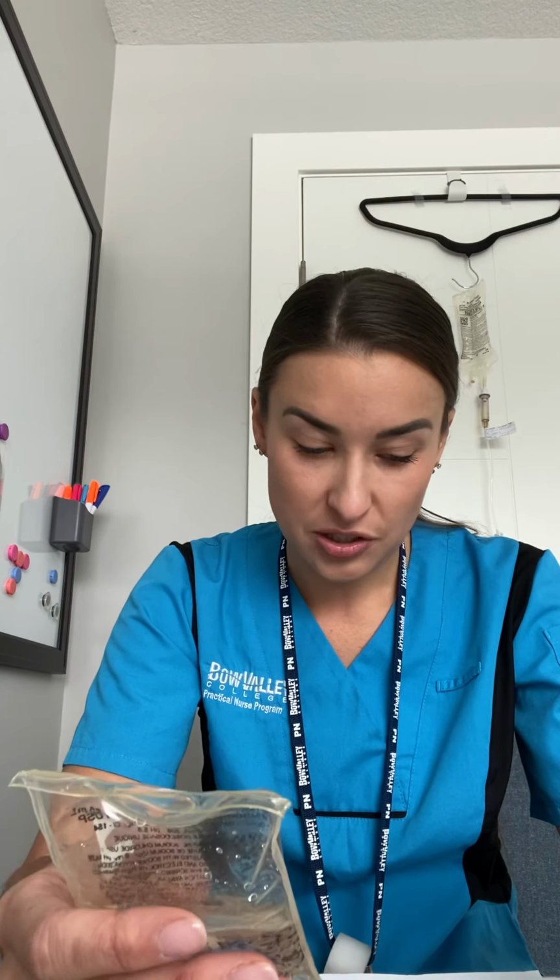we just want to go through the checks on our normal saline. So right here we have 0.9% sodium chloride. We're going to give it through IV piggyback, which is safe. We have 50 milliliters, which is safe here. And then the expiry date here is November 20th. Okay, so that's our first check. Then we want to do our second check. So we're checking it to the drug monograph here. So we have 0.9% sodium chloride.